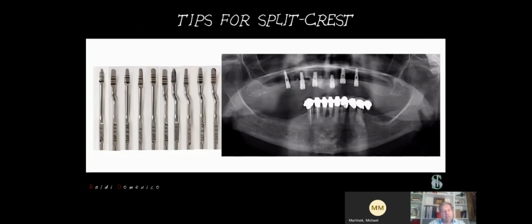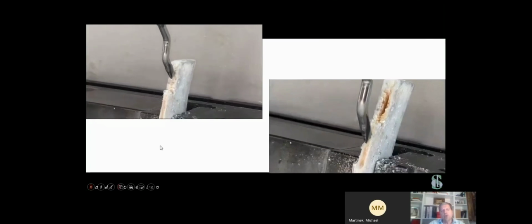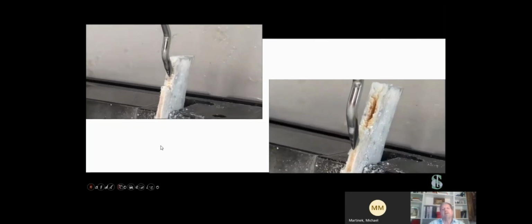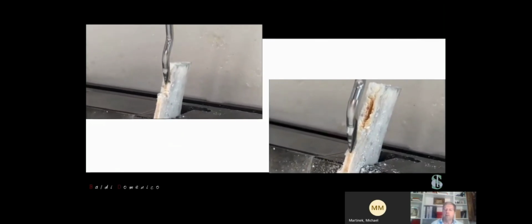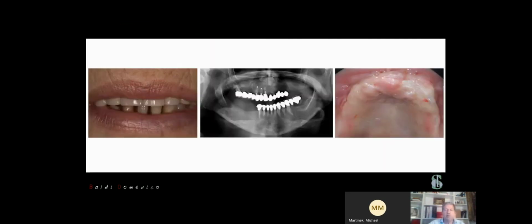And starting from this concept, we can go deeper in order to understand how we can manage the split crest. Here you can see on this bone how it's possible to control the movement of the instrument, to control the force of the instrument on the bone in order to have a good separation of the bone without damaging it. Look at these cases.